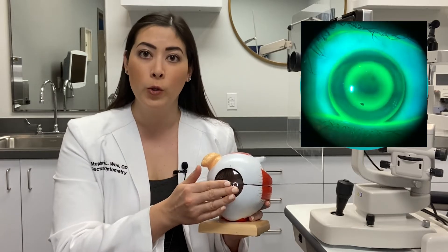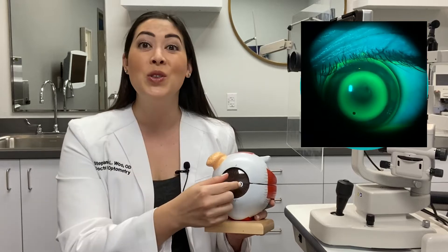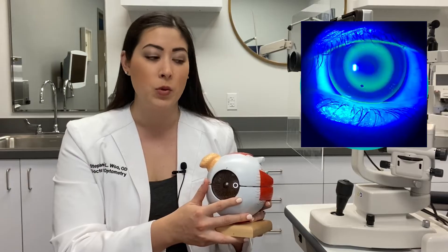So the center of the cornea is losing fluid and the forces are pushing it to the peripheral cornea, and that is kind of the basic premise of how orthokeratology works.